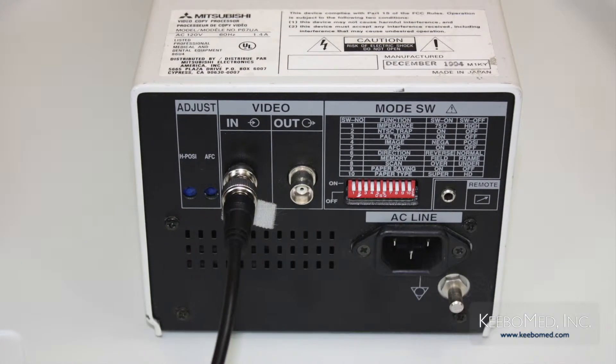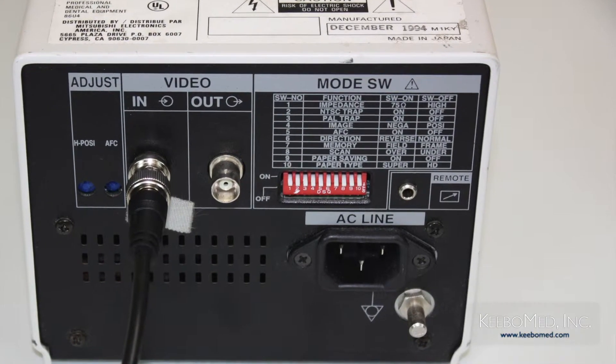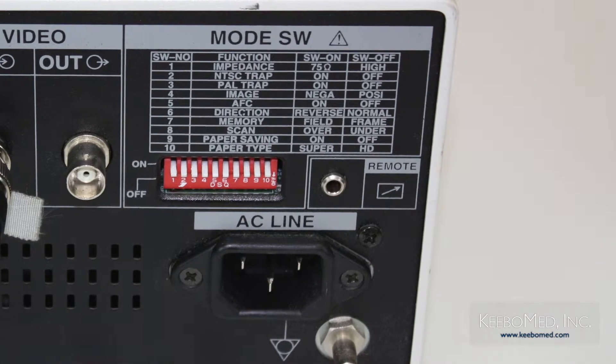Step three: if using a remote control for the printer, connect one terminal of the remote control cord to the remote terminal in the rear panel of the video printer.